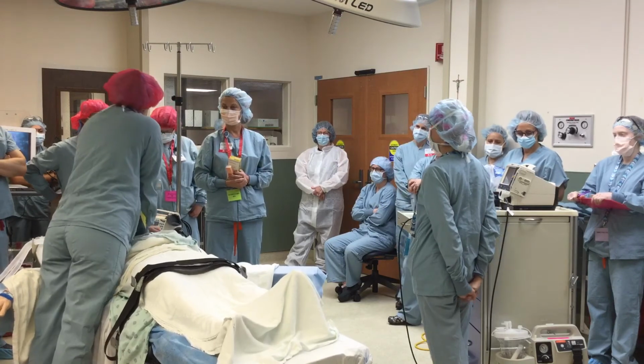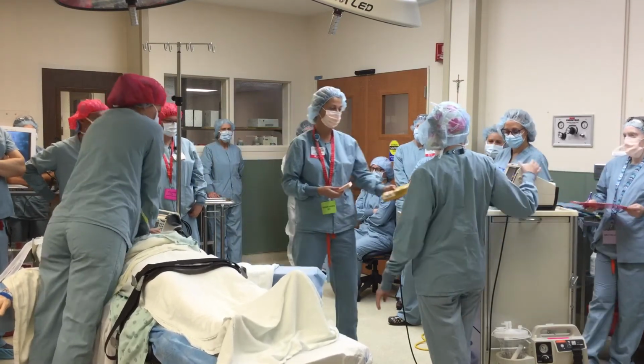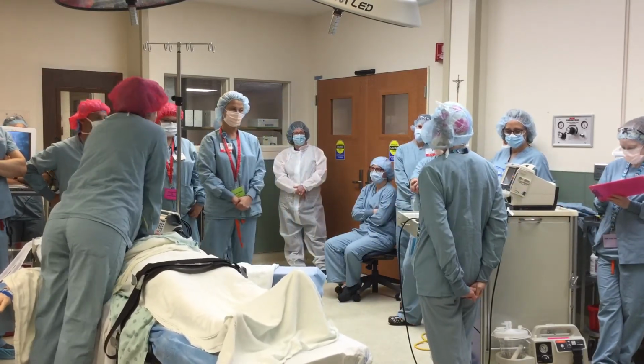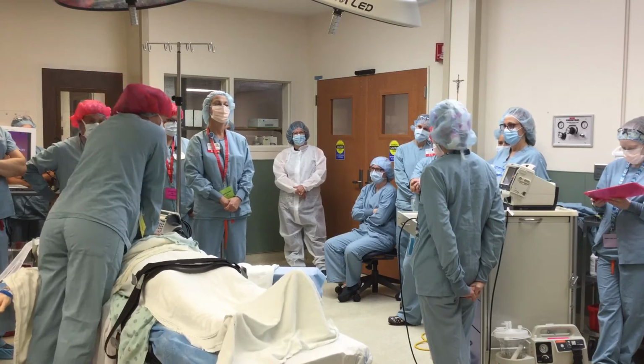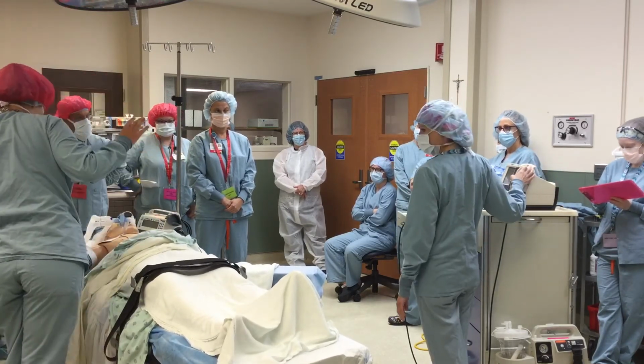So we're gonna continue with the CPR. We're gonna charge the 360 again, please. Okay, charging at 360. We withdrew all the labs, right? We sent all the labs already? Okay. All right, clear. All clear, please. Pushing the button.